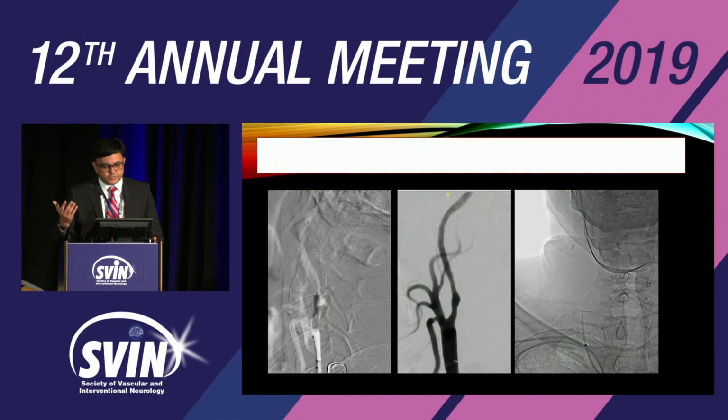And then we put a balloon, put a stent. The case went fine. So even if your catheter is right in the innominate, it gives you enough support to even drop a carotid stent. You don't need a catheter all the way up.